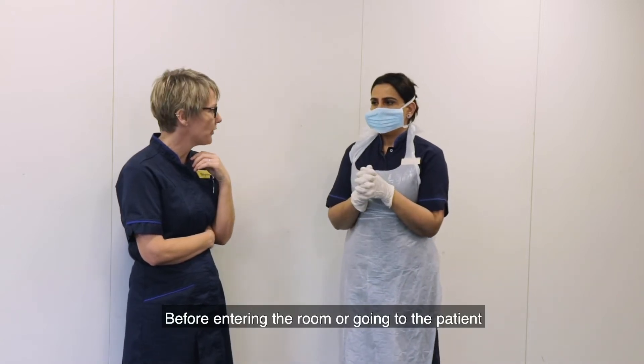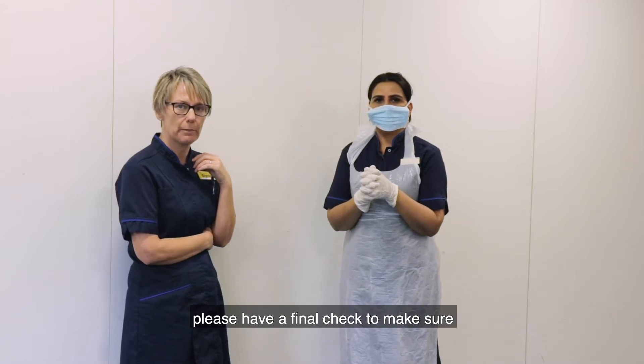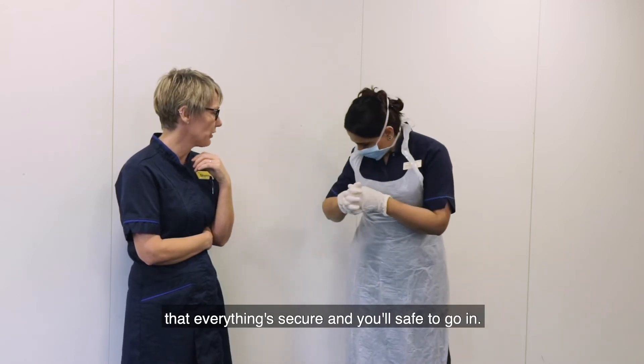Before entering the room or going to the patient, please have a final check to make sure that everything's secure and you're safe to go in.